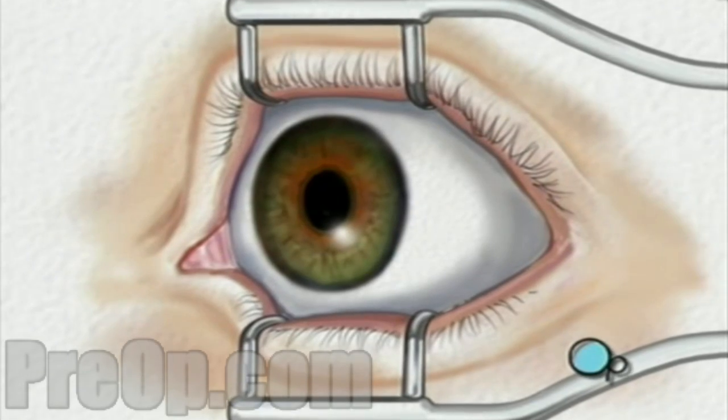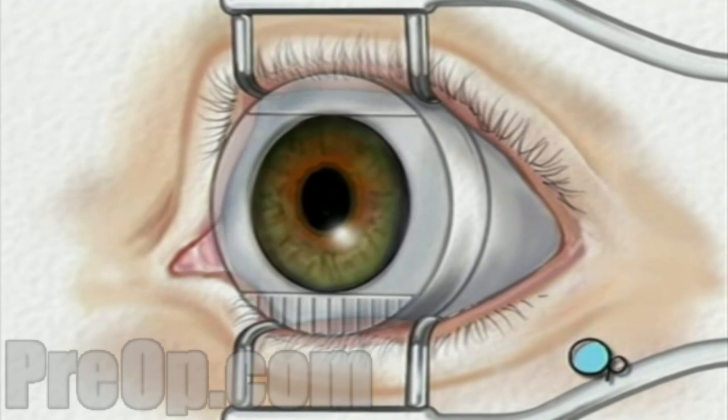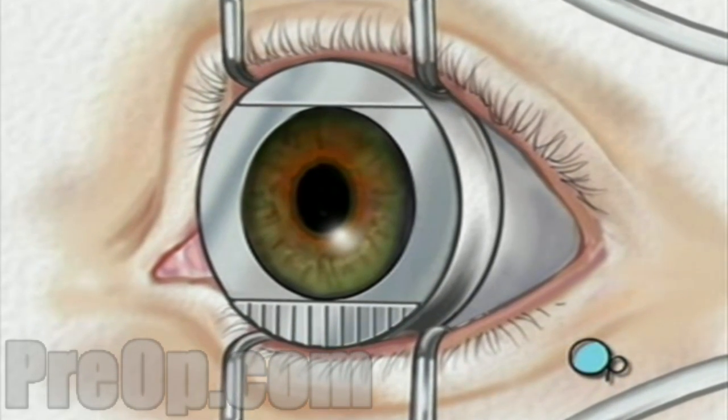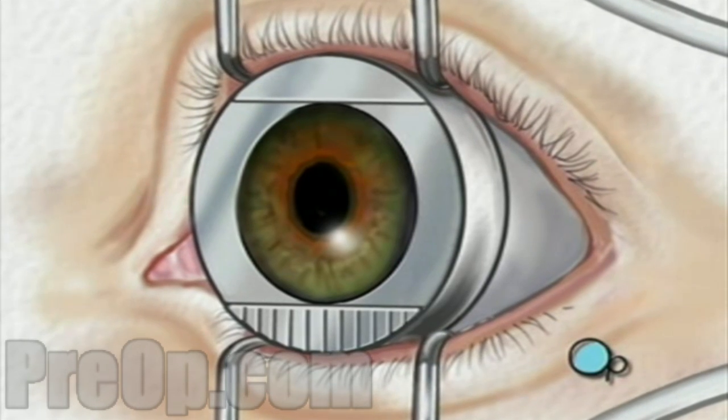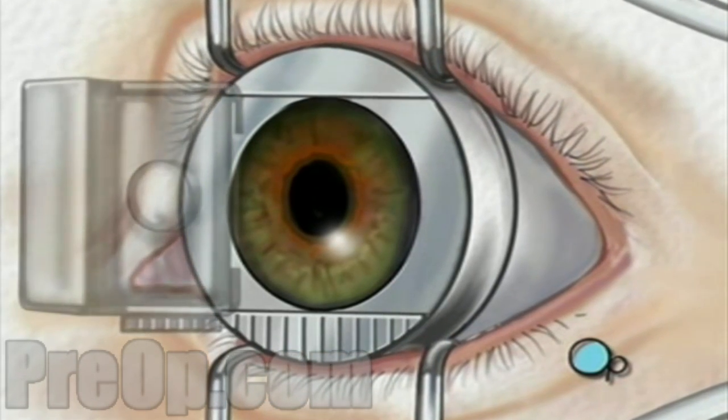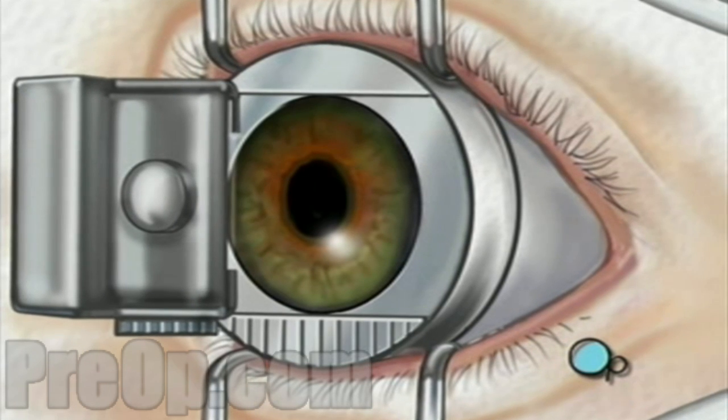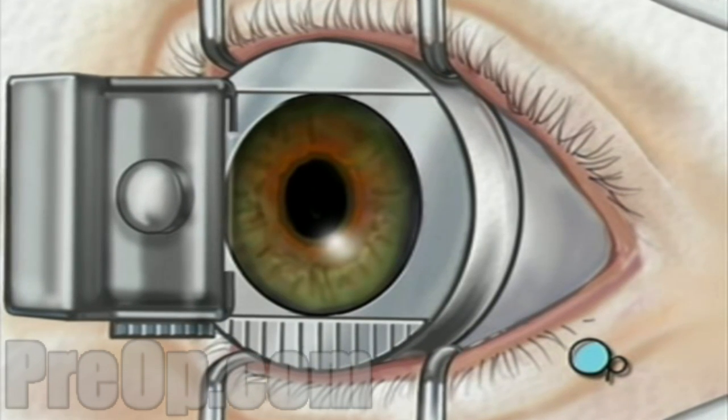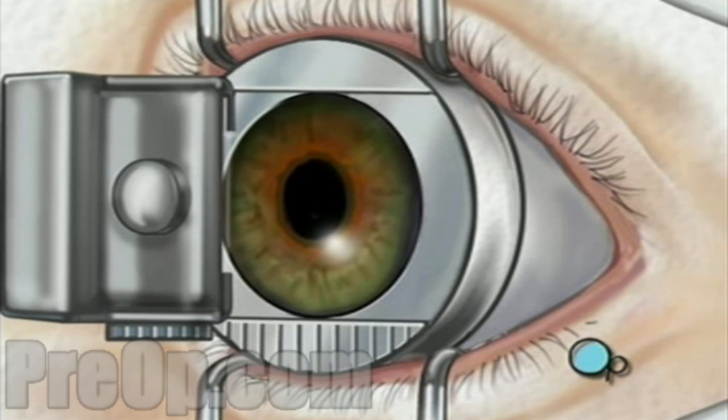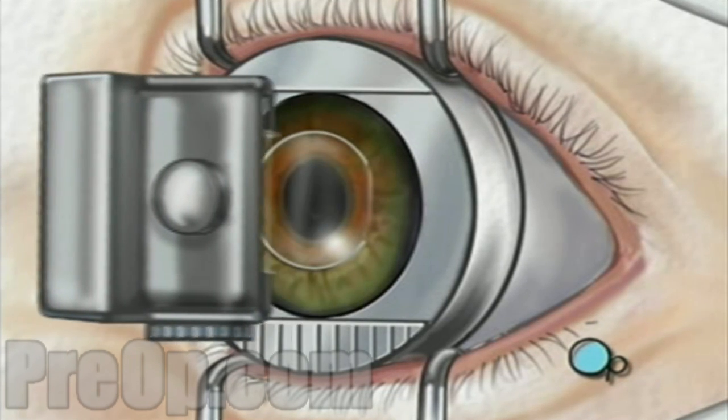A suction ring will be placed on the eye to prevent movement and to maintain pressure within the eye. When the operative field is numb, the doctor will use an automated microsurgical instrument called a microkeratome. This tiny instrument will carefully create a thin corneal flap, which remains hinged to the eye.